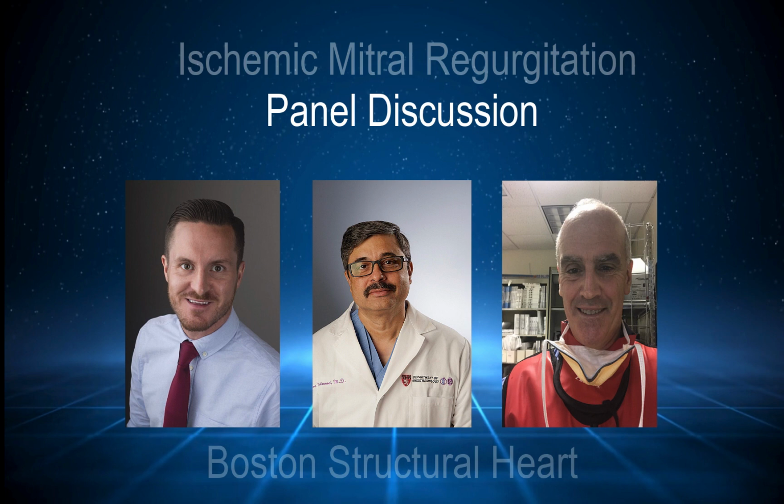So yes, but we also, I'd say half of us, capture a 3D volumetric data set and crop it down so we can measure a 3D regurgitant orifice. If there's discordance, which one do you believe? If there's discordance, I would believe the 3D regurgitant orifice area. I would actually argue that the more assumptions and the more reconstruction that are built into it, the greater the likelihood of error.